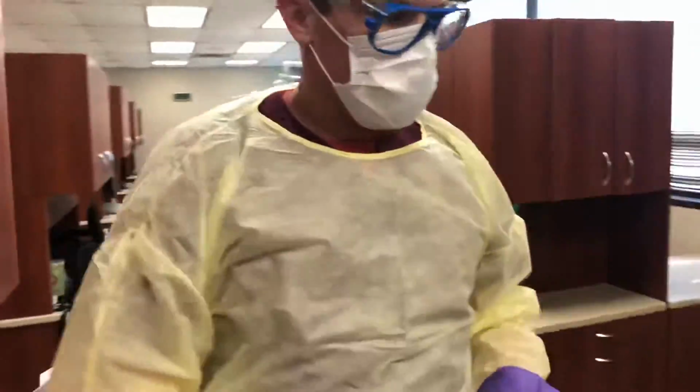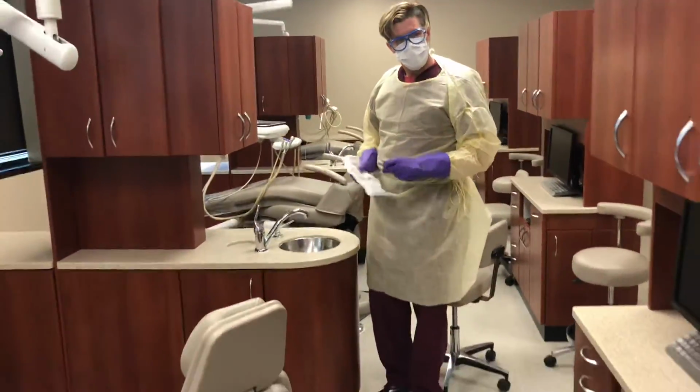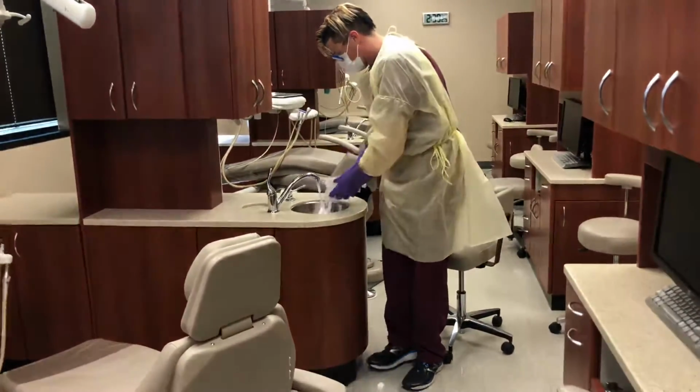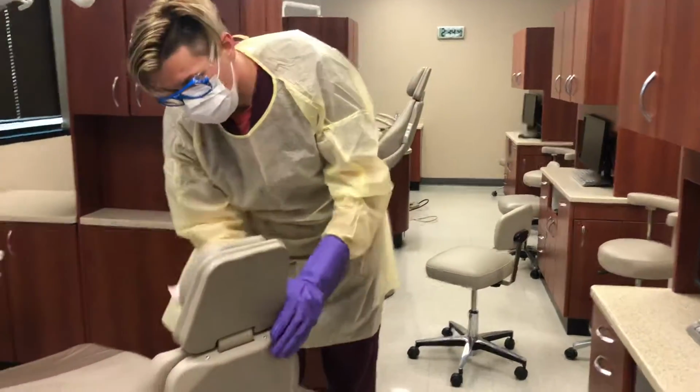Some units will not have cabinets on each side, so obviously you will just do what is in your specific area. Next is all vinyl on clinician chair, all vinyl on assistant chair, all vinyl on patient chair, including plastic cover for foot area.